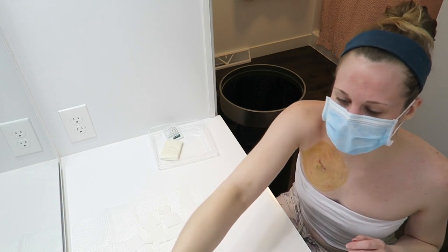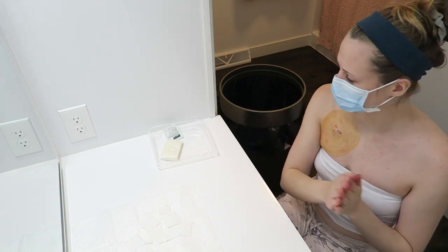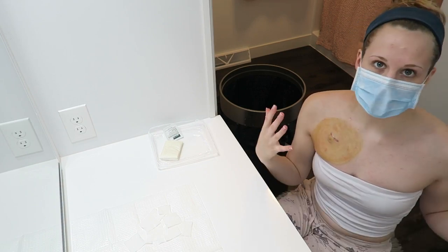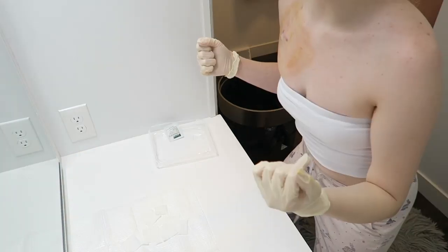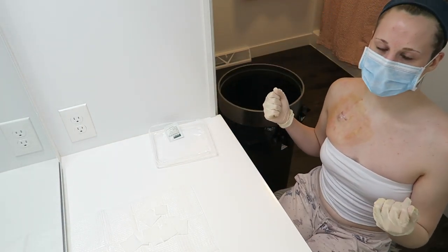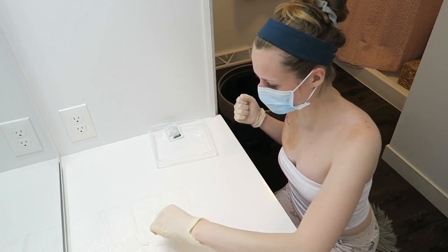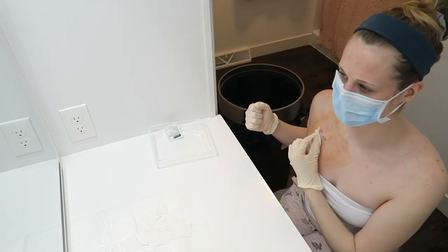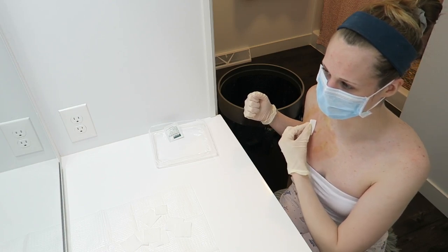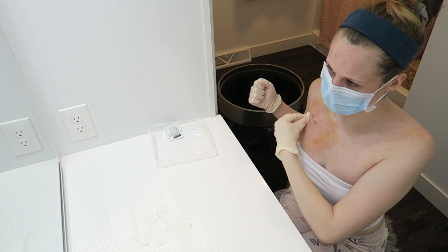We're gonna go ahead and use some hand sanitizer. And now this area should be dry by this point, and we can go ahead and remove the betadine with alcohol. So I don't know where that ended, but we have our sterile gloves on and we are cleaning off the betadine from my skin. So we are just pinching the alcohol pads, scrubbing the center of the port, and moving outward.